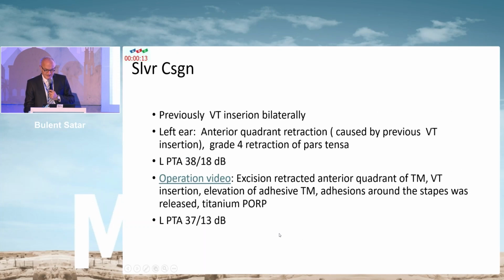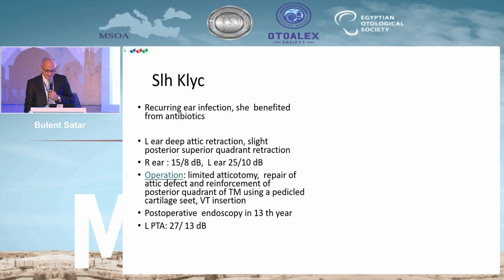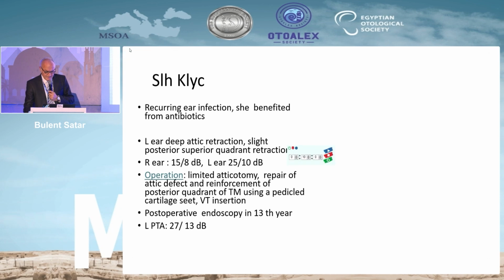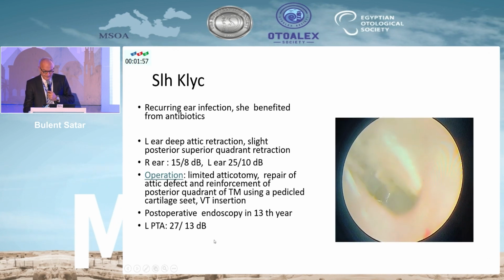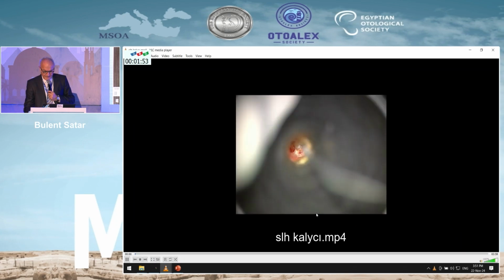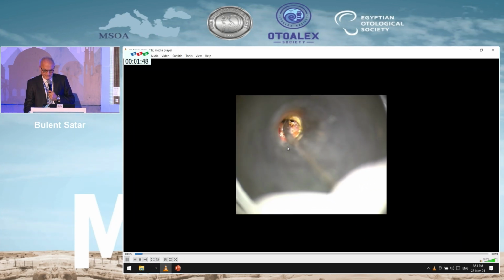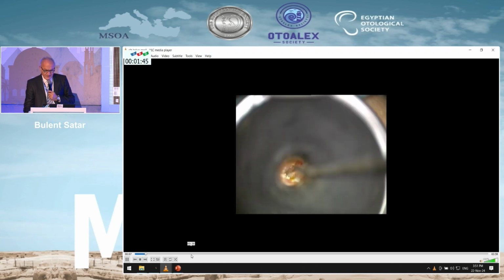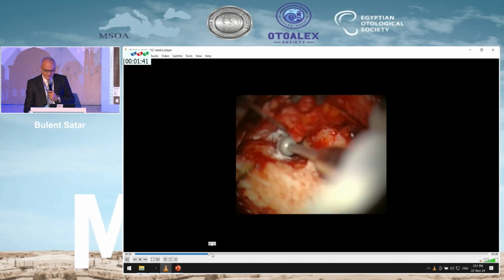Similar cases with cartilage. Actually, this case could be interesting. Sorry, I cannot move the cursor. Again, attic and posterior superior quadrant retraction. This operation dated back to 13 years ago.